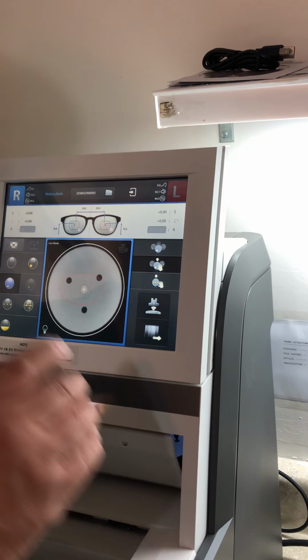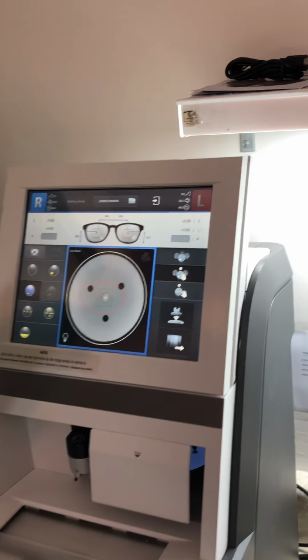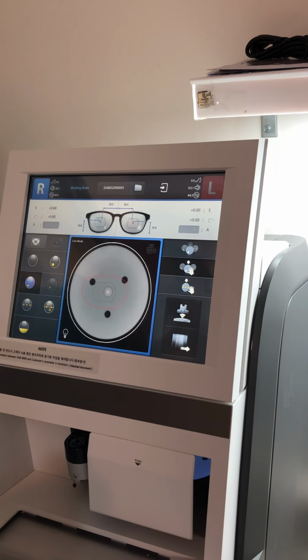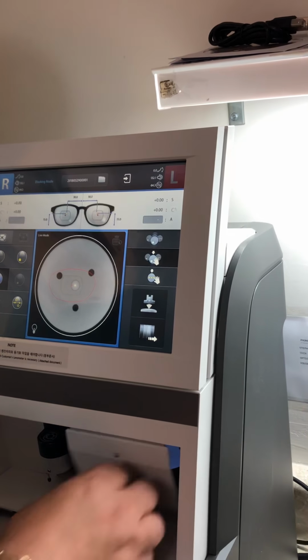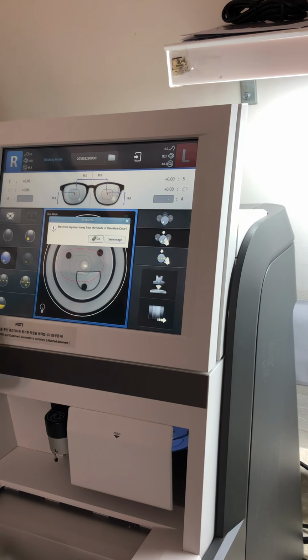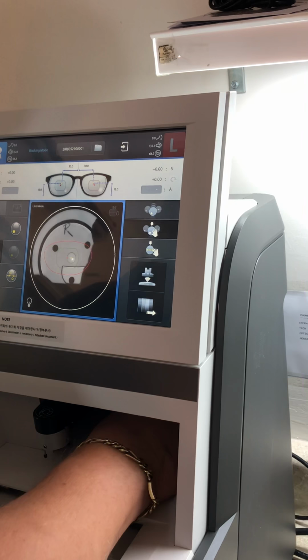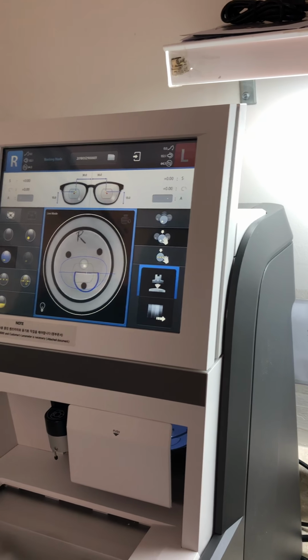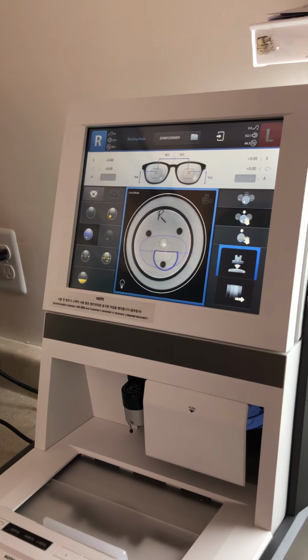What it tells me is that there's dust on it. So these lenses, when you're going to use the camera mode, they've got to be really clean. And what he doesn't like either is that it's a little bit too close. So flat top 28, 35, let the camera go. He'll pick it up like that.